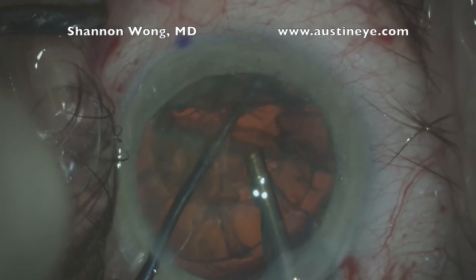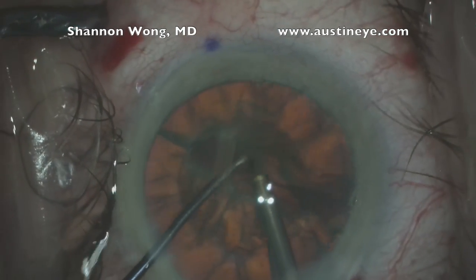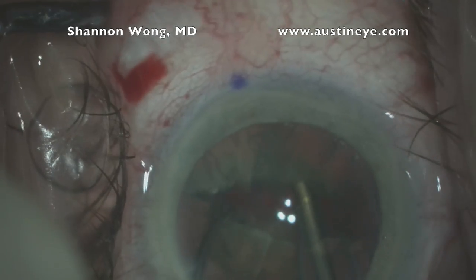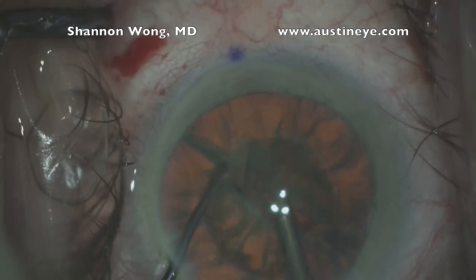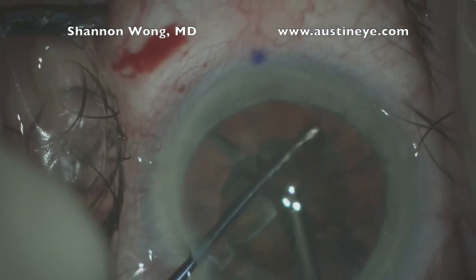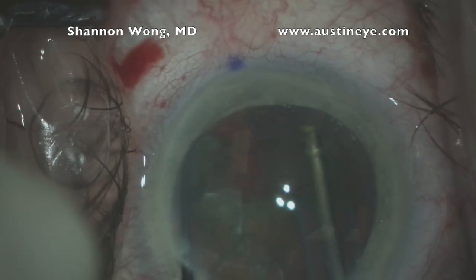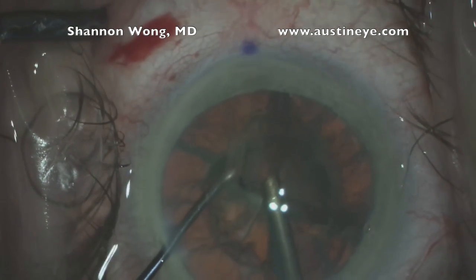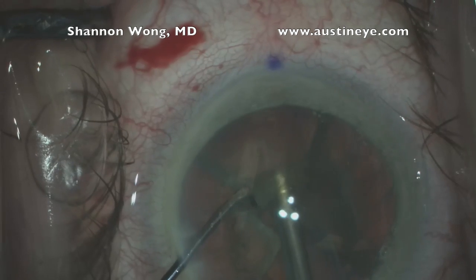The lens spins in a normal fashion and we have at this point divided the lens into two pieces. I split it into now three pieces — two quadrants and one hemisphere.